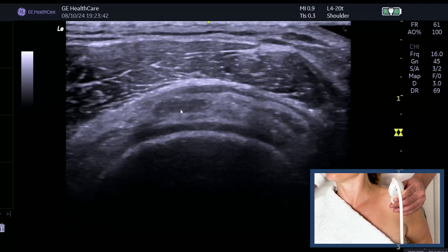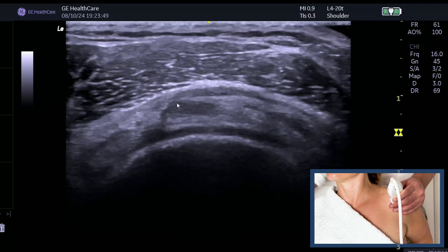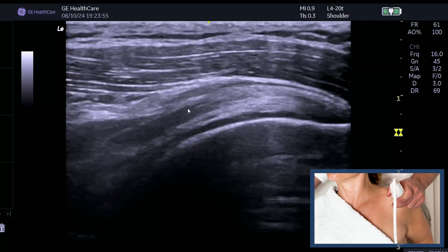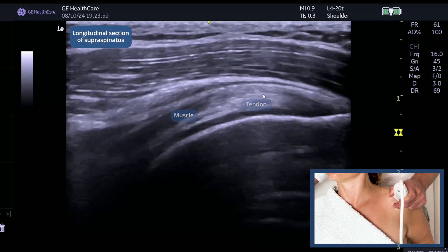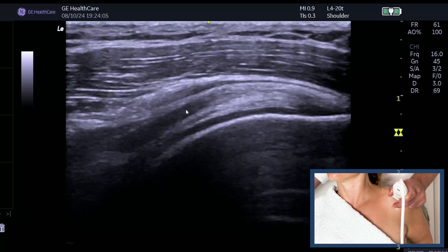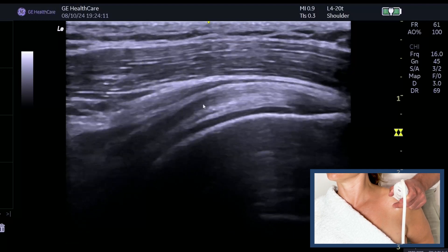You can see exactly the same on this lateral aspect as well. If we put that in the middle and spin on it carefully, you can quite clearly see that this is the musculotendinous junction of supraspinatus — this is the tendon here, and then this is the musculotendinous region. So don't mistake those hypoechoic regions in that proximal tendon for a bursal-sided tear.